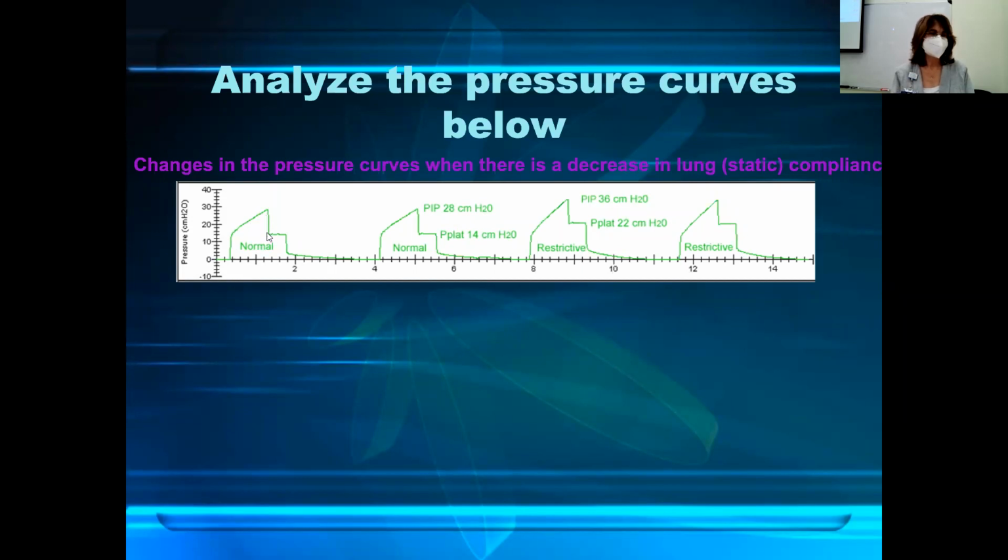I need to draw a normal. Let me see if I can draw a normal. Pressure, and this is time. So this has got a little something added to it, an inspiratory hold, but what does it look like if the inspiratory hold wasn't done?